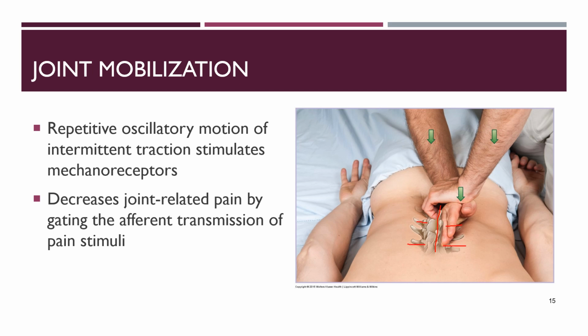So this is what we call a unilateral posterior to anterior force. So you can see that the force is moving from the posterior side, the person's back, essentially towards the anterior portion of their spinal column, okay, or towards the front side of their body. So this has been studied quite a bit, and it's a really good technique to help manage pain, increase range of motion, but we're not going to really focus on that so much, at least the manual components.